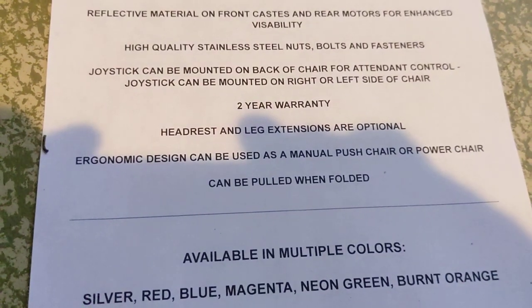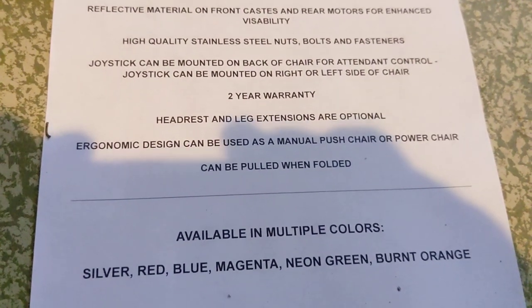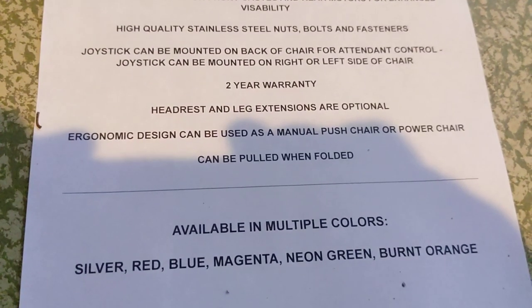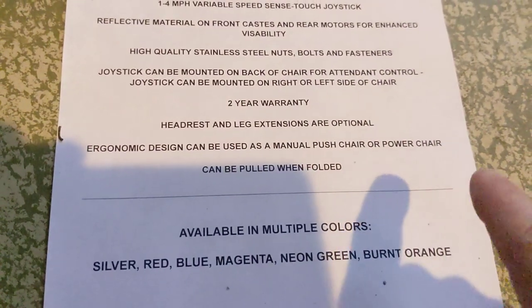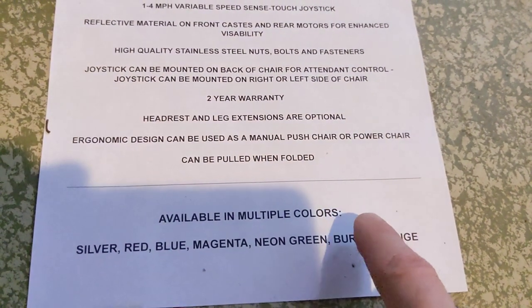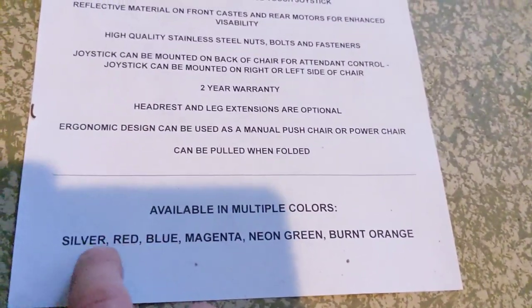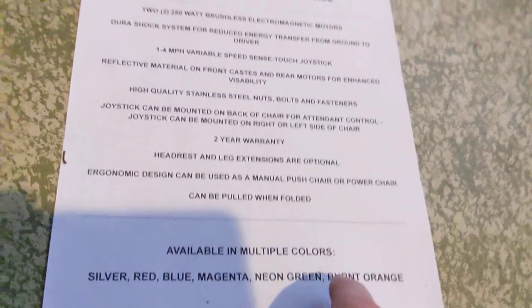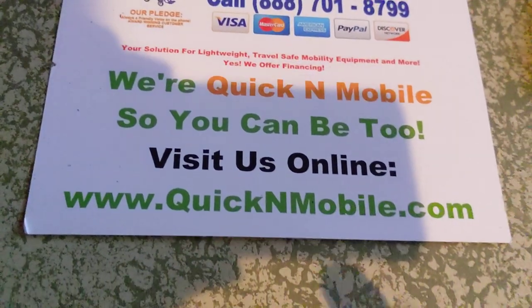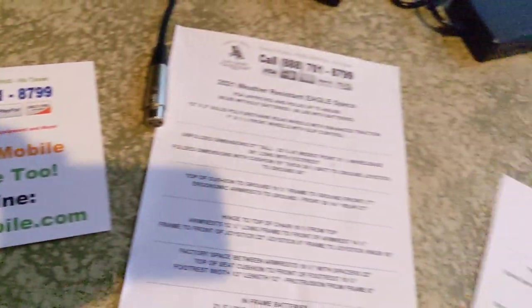We have a two-year warranty: first year is parts and labor, second year is parts. The headrest and leg extensions are optional ergonomic add-ons. The chair can be used as both a manual push chair and a power chair. It's available in multiple colors — silver, red, blue, magenta, neon green, and burnt orange — and you can find pictures of all of those on our website.